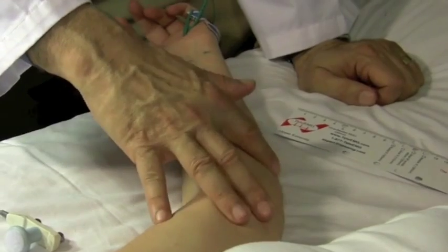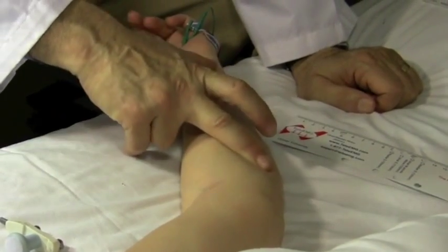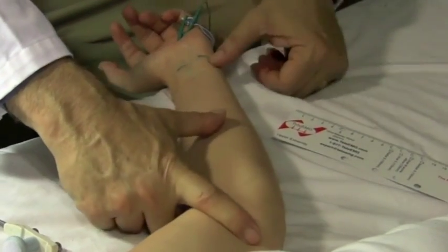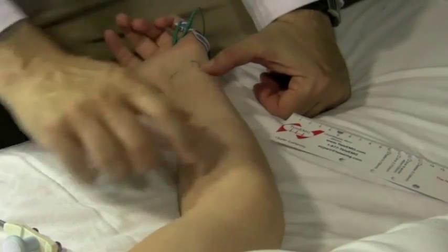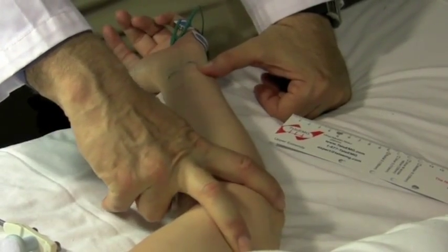But if the nerve is not completely severed or not completely damaged, if I stimulate from here to here, it's going to be okay. It's when I stimulate from here to here that the nerve is going to go through the elbow and be slowed. So that allows me to localize the nerve lesion at the elbow, essentially.